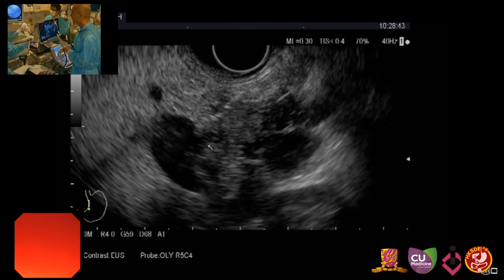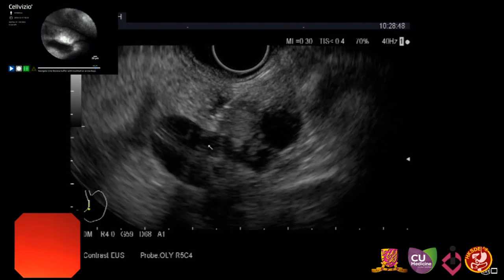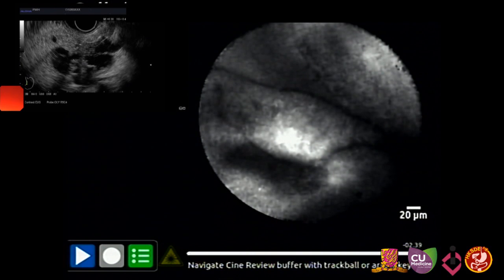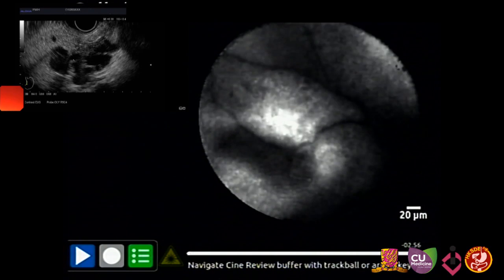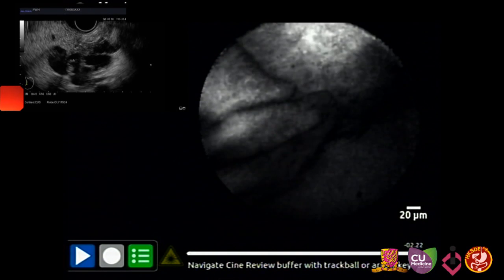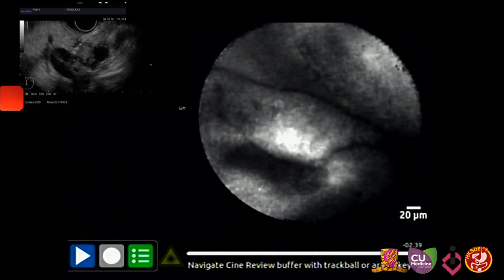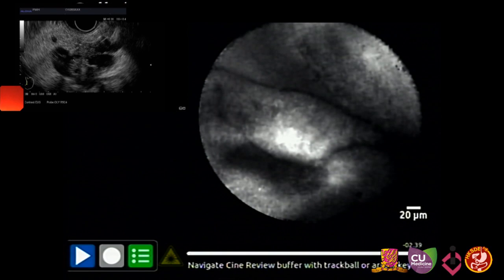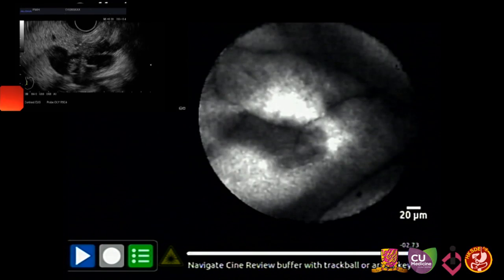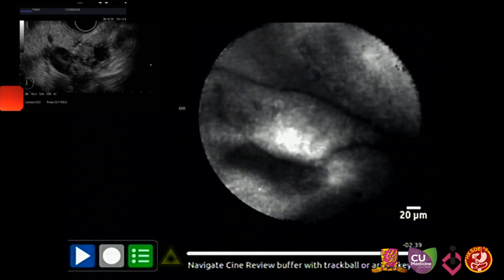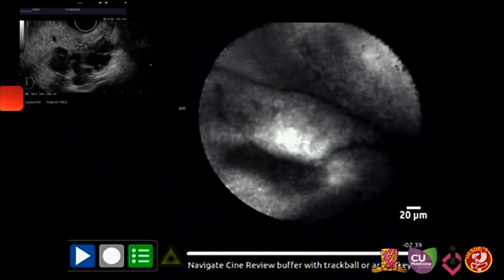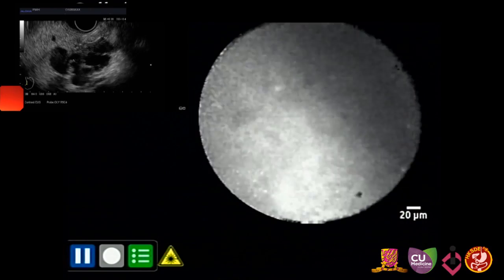It's different from doing confocal on the mucosal surface. These are the typical papillary projections we see on the surface of IPMN — a lobular modification of the surface contour inside the cyst. We want to see if there are any potential malignancies within this area. Right now I'm still seeing IPMN appearances — I don't see definite malignant features, which would be dark, very irregular bands.